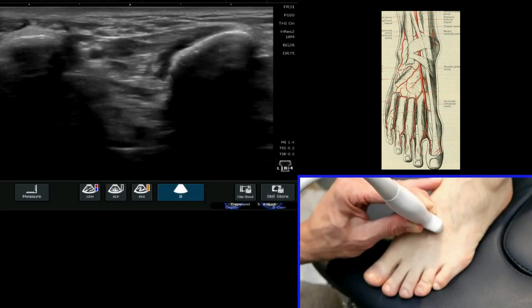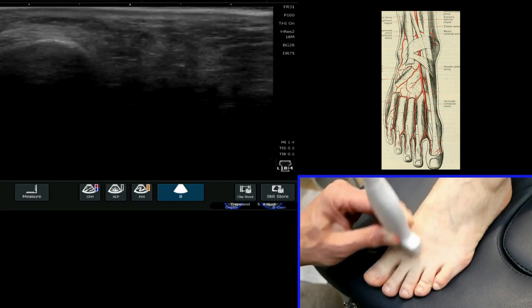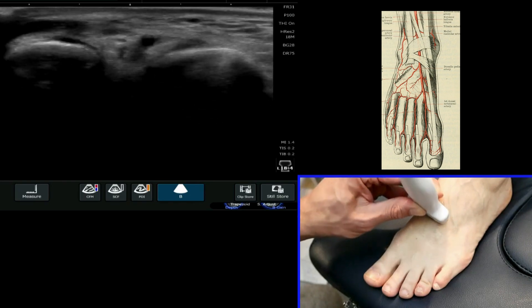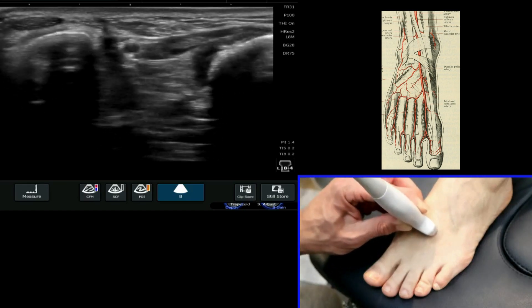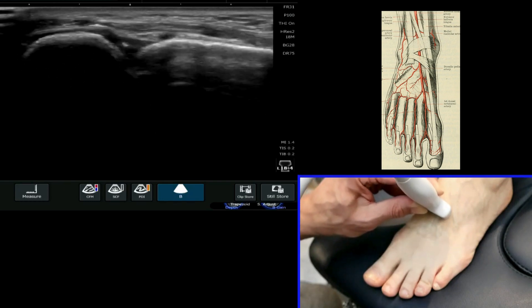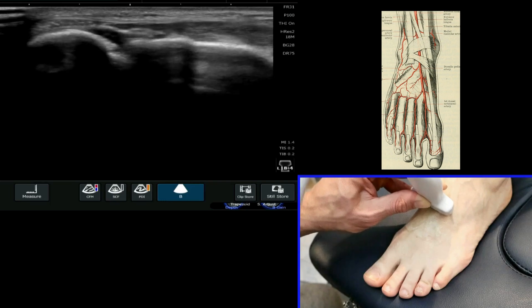We're now going to have a look and see if we can see the dorsalis pedis artery. This lies between the first and the second metatarsal in the foot and we can see it quite clearly on ultrasound in the majority of cases. It's important to know where it is, particularly when you start to think about doing tarsometatarsal joint injections, because you want to know where it is.